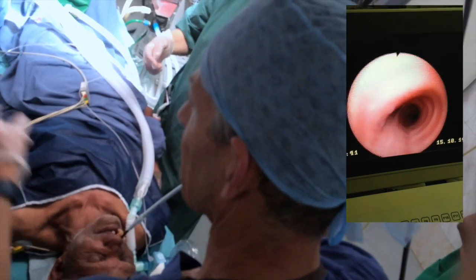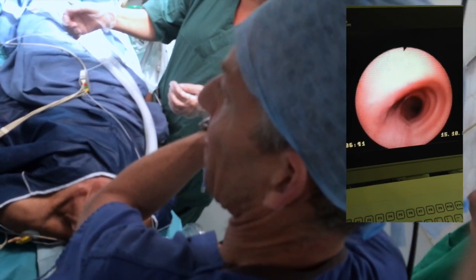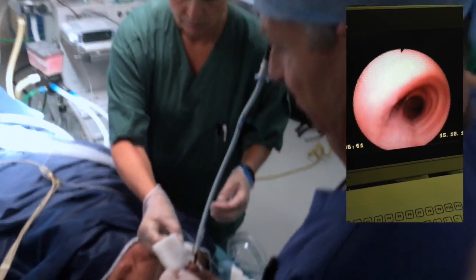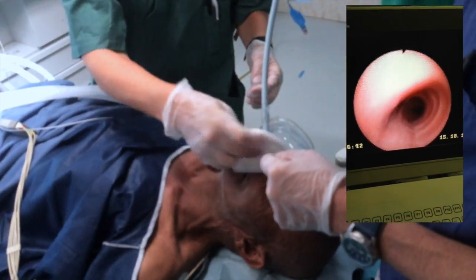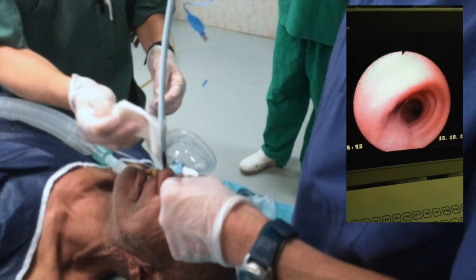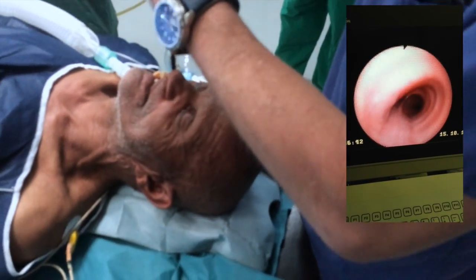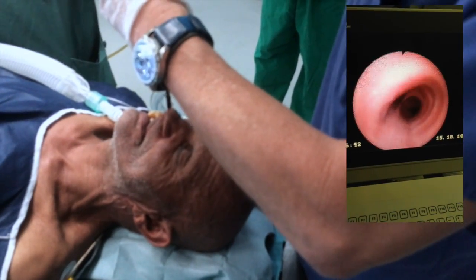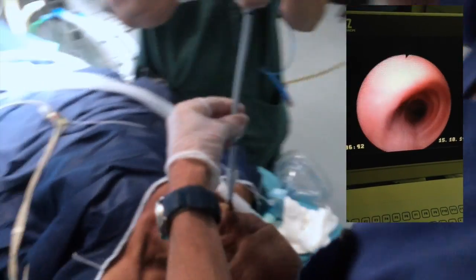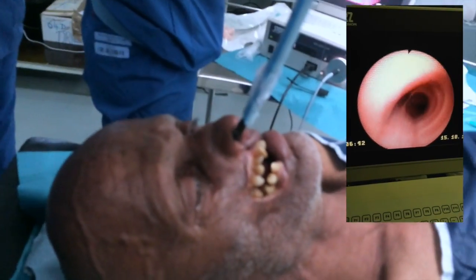I need some Alison KY gel on a swab. So explain your tricks. Okay, so we're going to lubricate the scope now, between where the scope and the tube is. It's going to railroad the tube. Why do you do that? In order to allow it to traverse or railroad over the fibroscope freely. Now what I'm going to do as well is orientate the bevel of this so it points posteriorly. So if you can take a look, the bevel is pointing posteriorly.